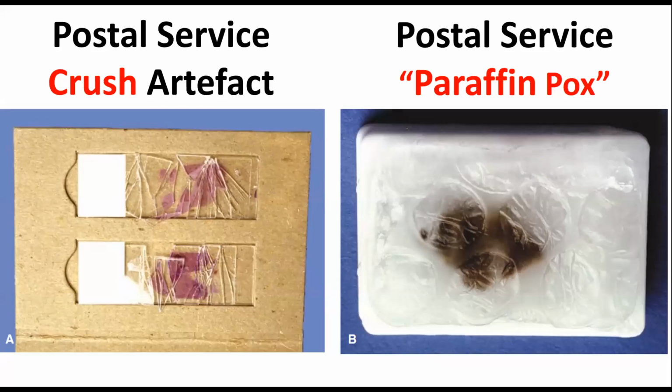Usually you'll see a broken slide, but it's usually just a single crack. I used to get these a lot when I was a neuropath fellow at Duke. This was actually, I think, an MD Anderson case that came in over the transom, as we will, and the community pathologist would put these glass slides. This is cardboard, and it was a mailer.